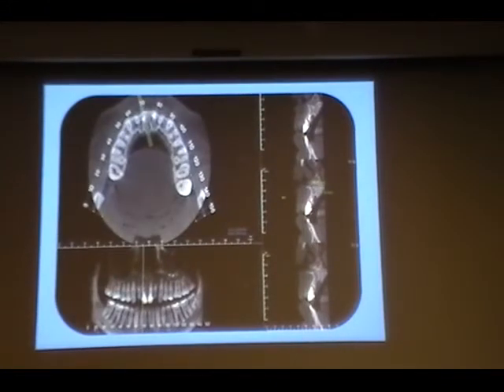So here is a clinical example, basically. Again, remember guys, this is called crosshairs. That's the guiding point for where the structure or region of interest is that we are trying to look at. And if you look at this axial slice here, you can see 3 green lines, right? 1 and 2 and 3.